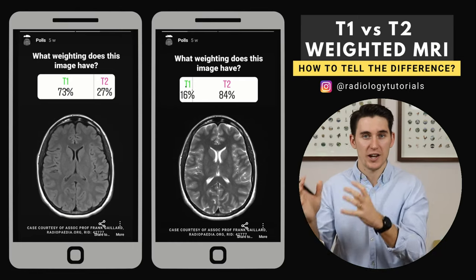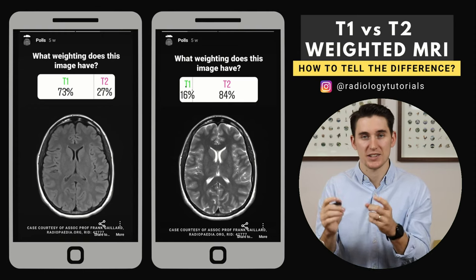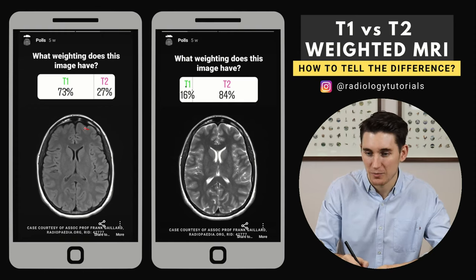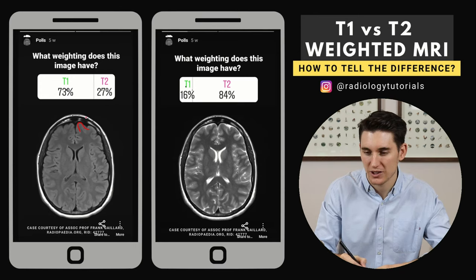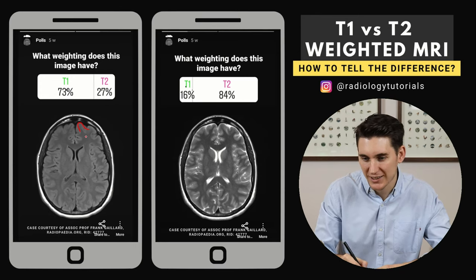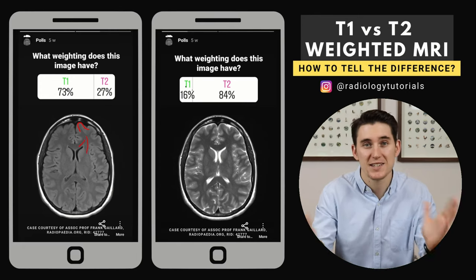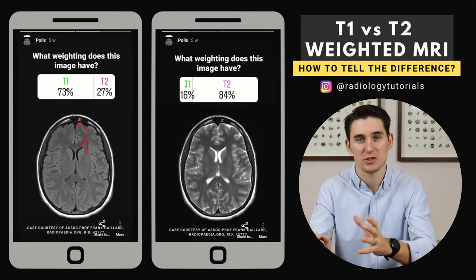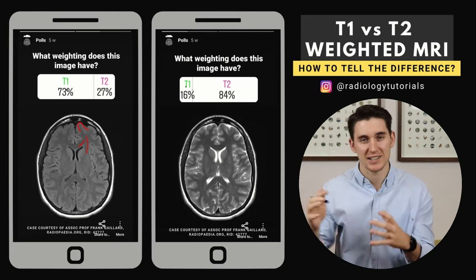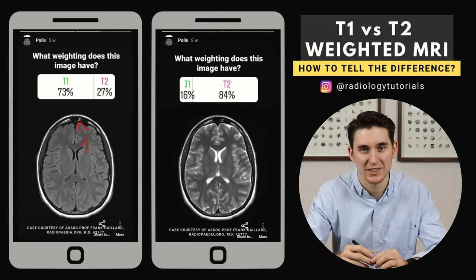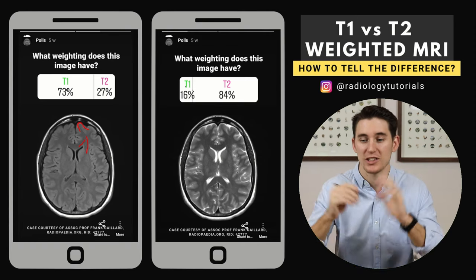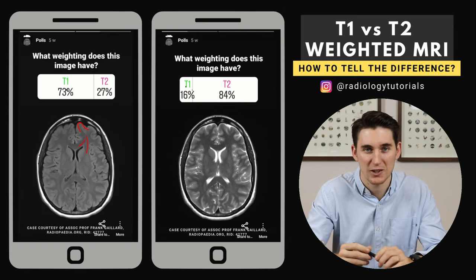Logically, gray is darker than white, so we want to check whether that fits the same logic on the image. Looking at the gray matter on the sulcal surfaces of the brain and these gyri, the gray matter here is actually lighter than the white matter tracts within the brain. So here's the tip: if the gray matter is lighter than the white matter, it's a T2 weighted image. If it's the normal way around — gray matter darker than white matter, as you would logically expect — then that is a T1 weighted image.